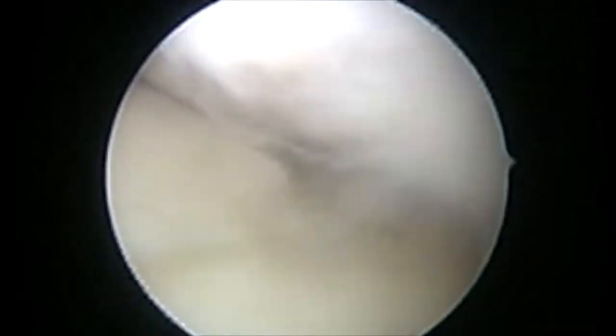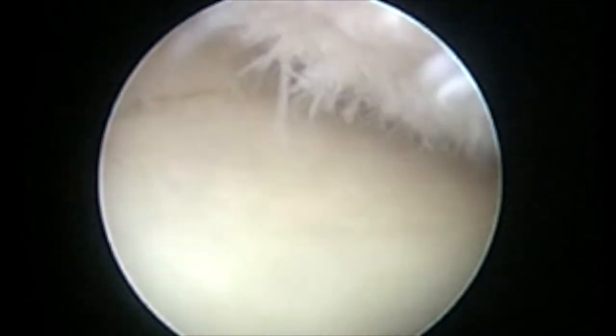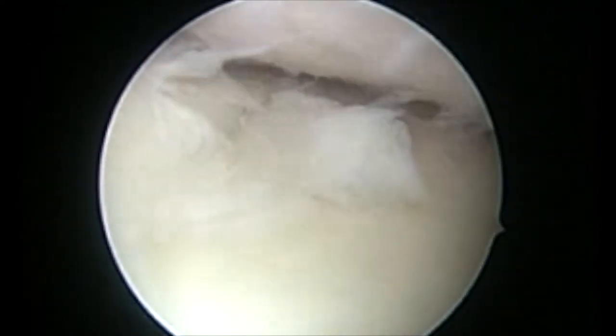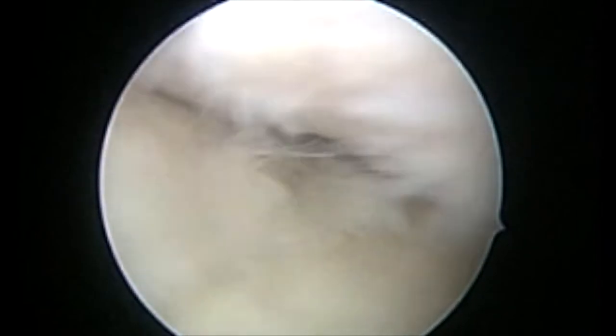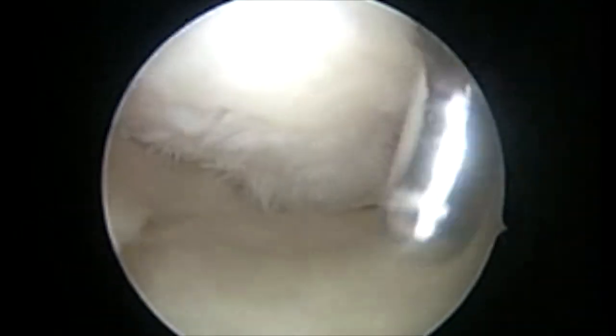Now coming back to the index case, we see a lot of degenerative changes on the femoral condyle. At the same time, there is a complex meniscal tear in the posterior horn of the medial meniscus.